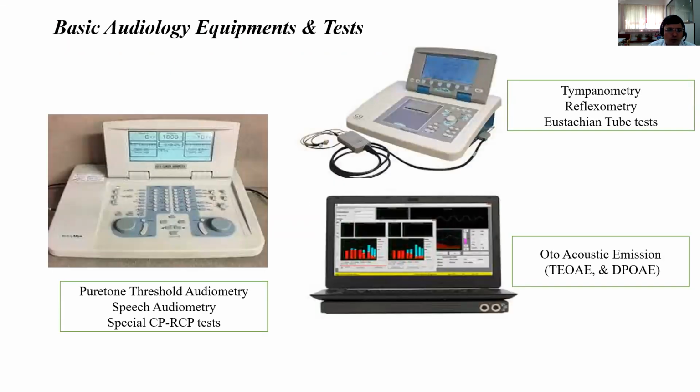I'm sure most of you must be well versed with this particular equipment. This is a diagnostic pure tone audiometer, which helps us to assess pure tone audiometry, speech audiometry, and some of the special tests to differentiate cochlear pathology and retrocochlear pathology.